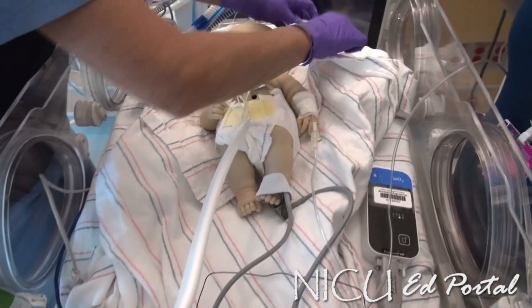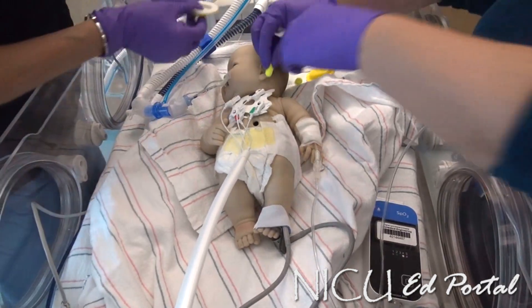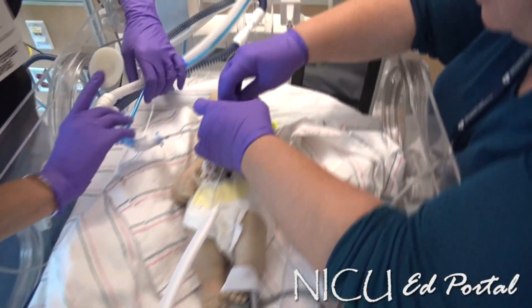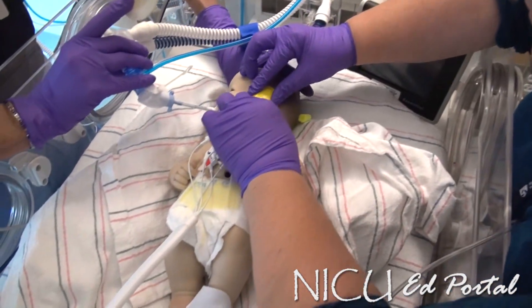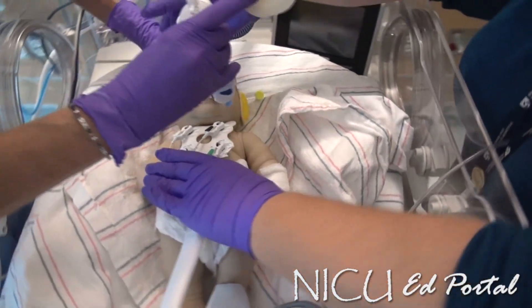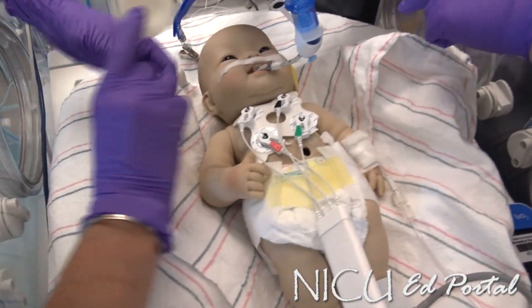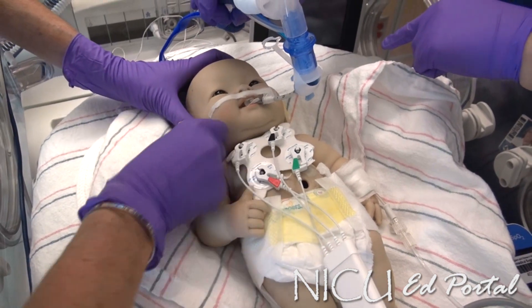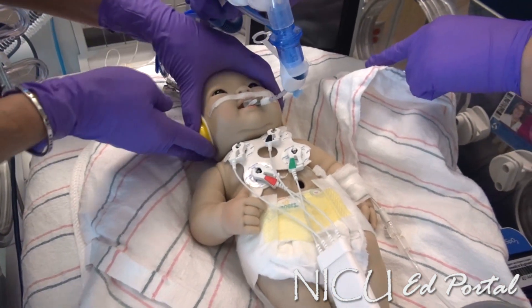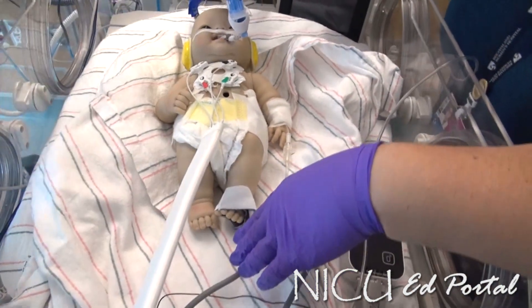Now here comes the tricky bit. We put him on his left side first for the ear protection. I'm going to move him midline while he has his breathing tube in — if you could hold the tube for me, Tina, that's fantastic. The final stage for Patrick is to get him nicely swaddled and protected from these wires that are currently touching his skin.